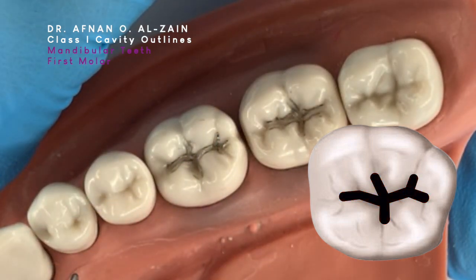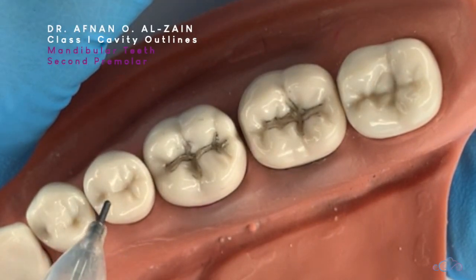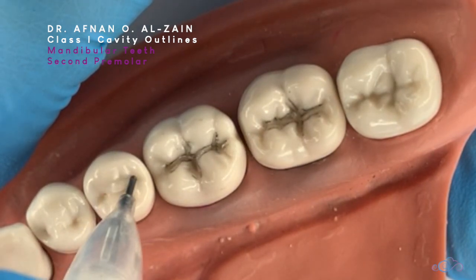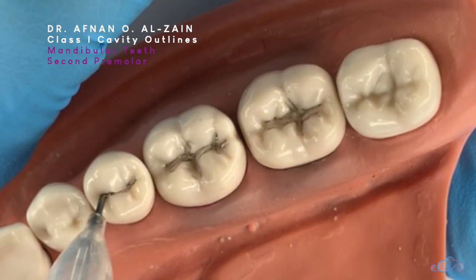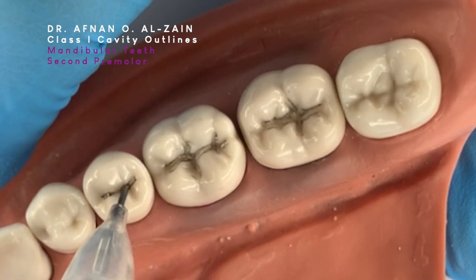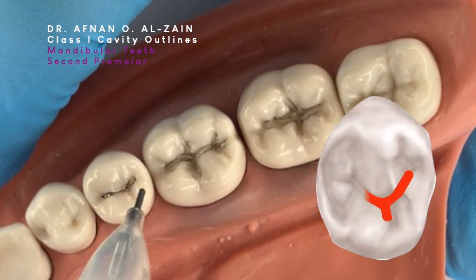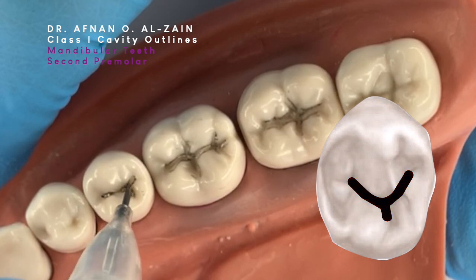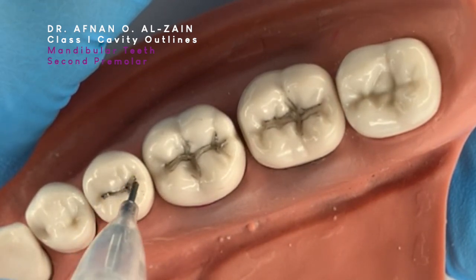In our outline, we include only the main grooves and not the supplementary grooves. Moving on to the second premolar, or tooth number five. It's the same principle — we're going to go from one triangular fossa to the other triangular fossa going through the central groove. In the lingual, we don't forget that we have two cusps, so we have to go through the lingual groove. We also extend it halfway so as not to weaken the lingual cusps. This outline looks like a Y shape.